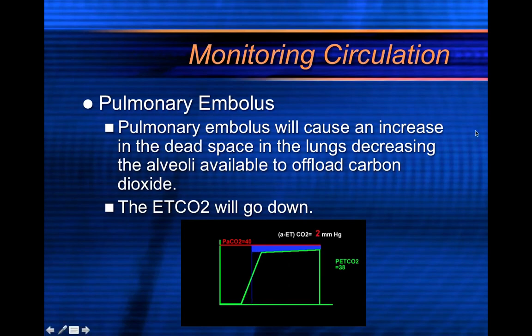So if you see a decrease in levels due to this alveolar dead space, you're not going to see obviously this image happen just like this, but you've got to think, okay, are they having a pulmonary embolism? And if they are, you may see a change in your capnography that correlates with this image.